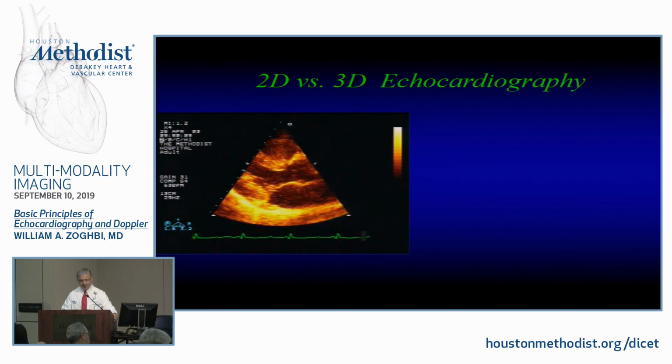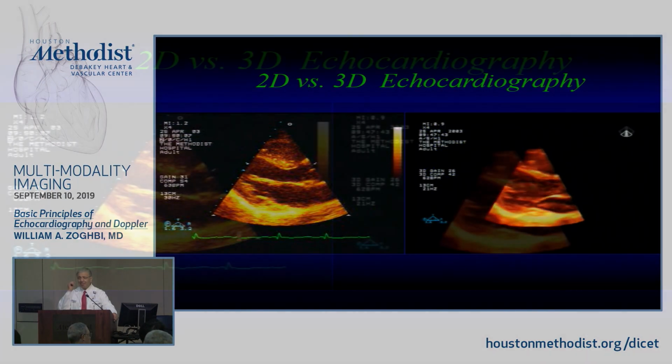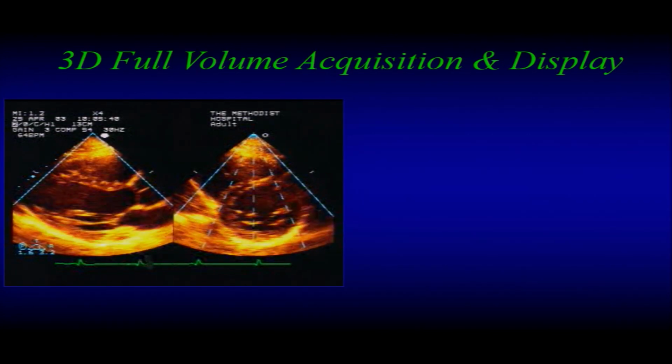I wanted to keep those because this is our first, it is around February, April 2003, okay? Time has flown by. And actually, these images are from nowadays a cardiologist and attending somewhere. We're not gonna name who this person is. Okay, but this is 3D then. And at that time, you had to use multiple acquisition.